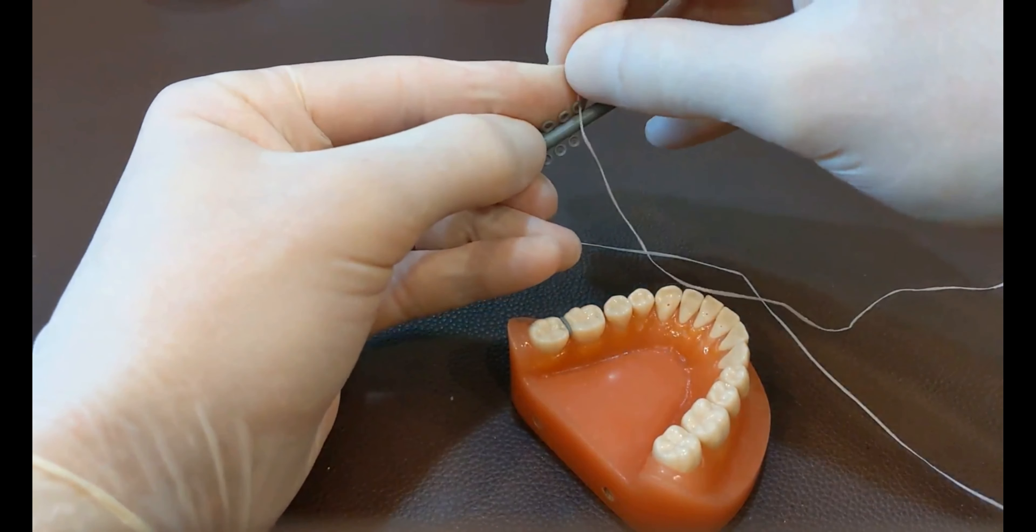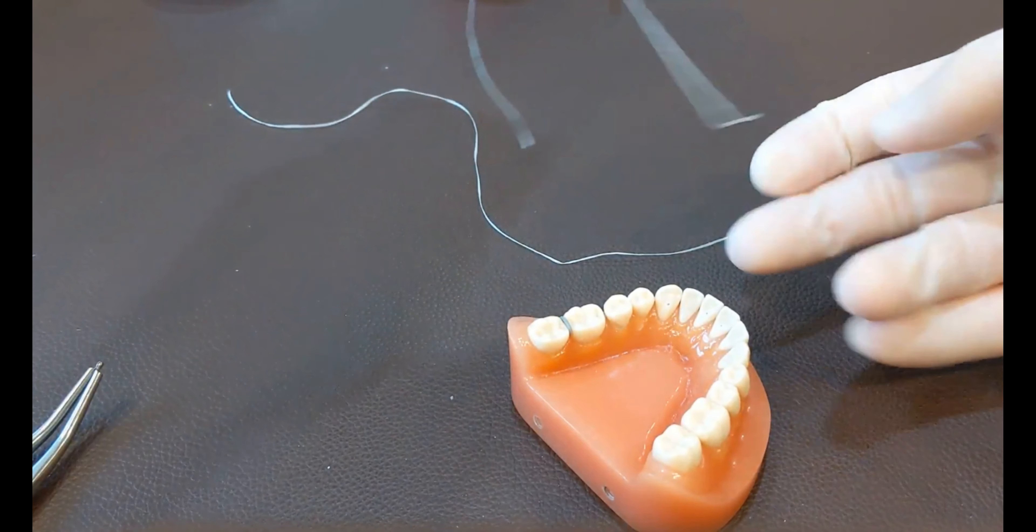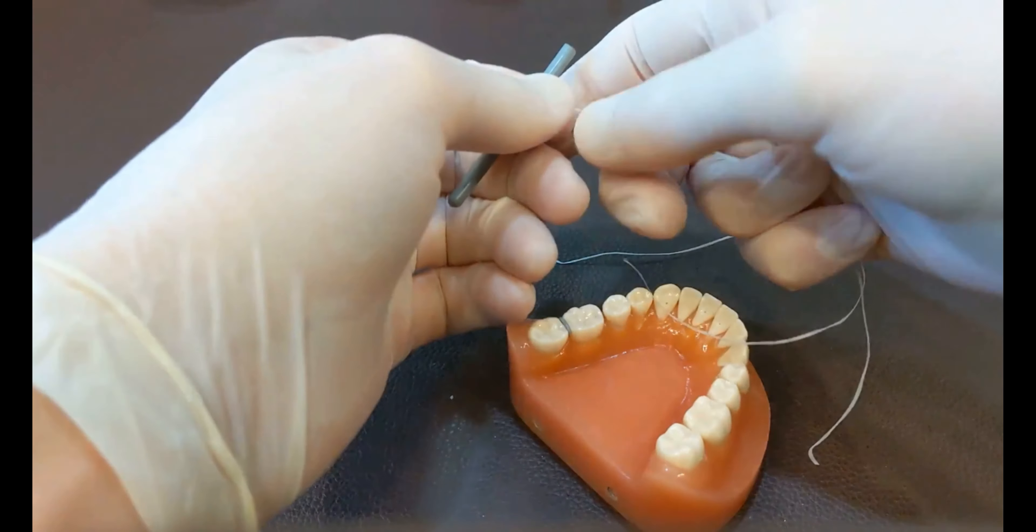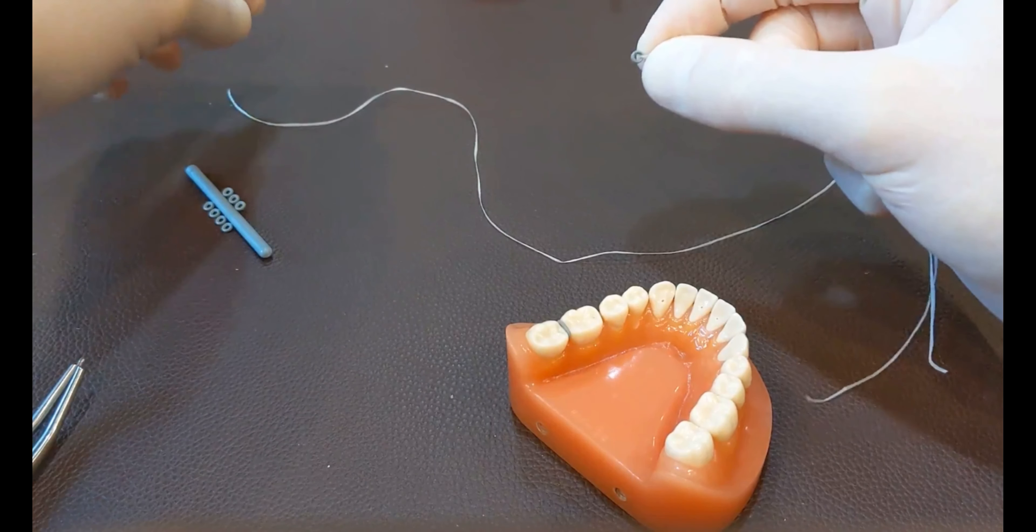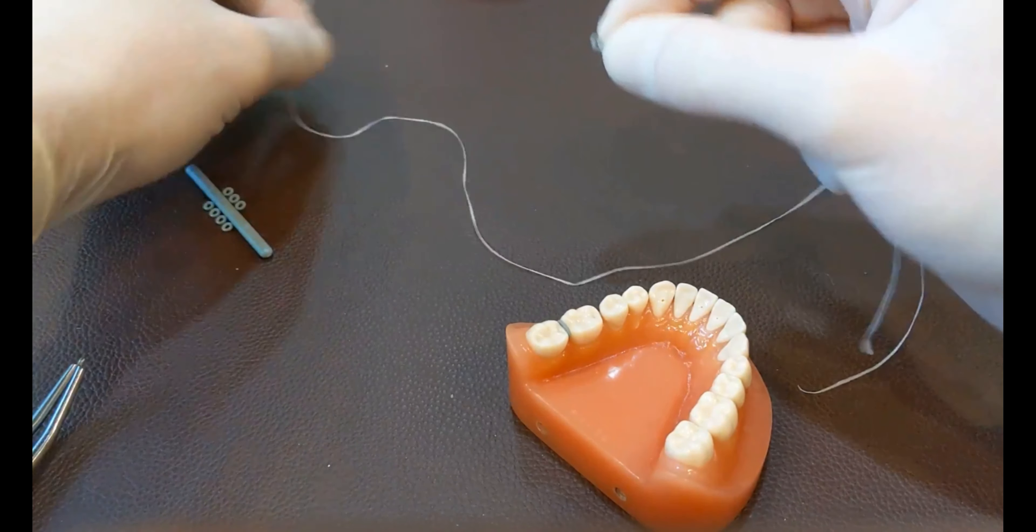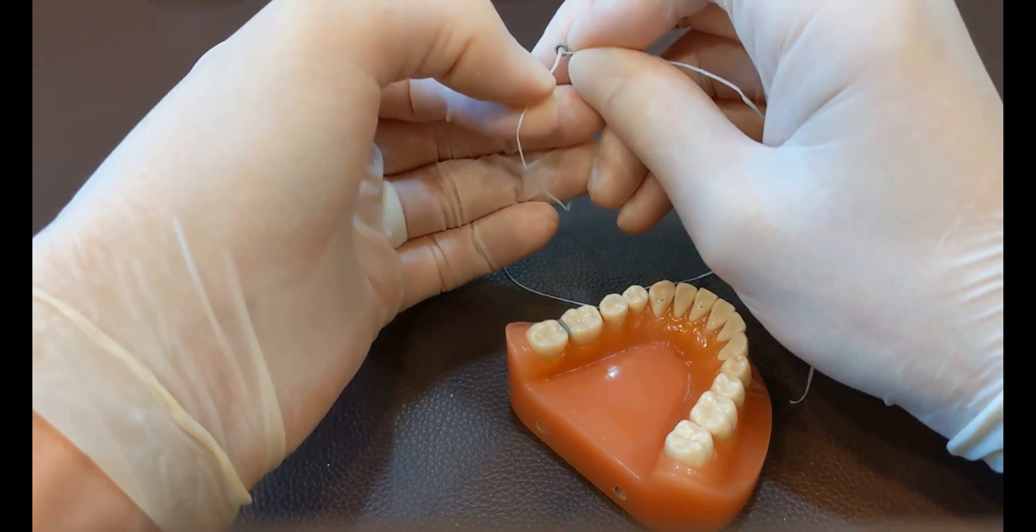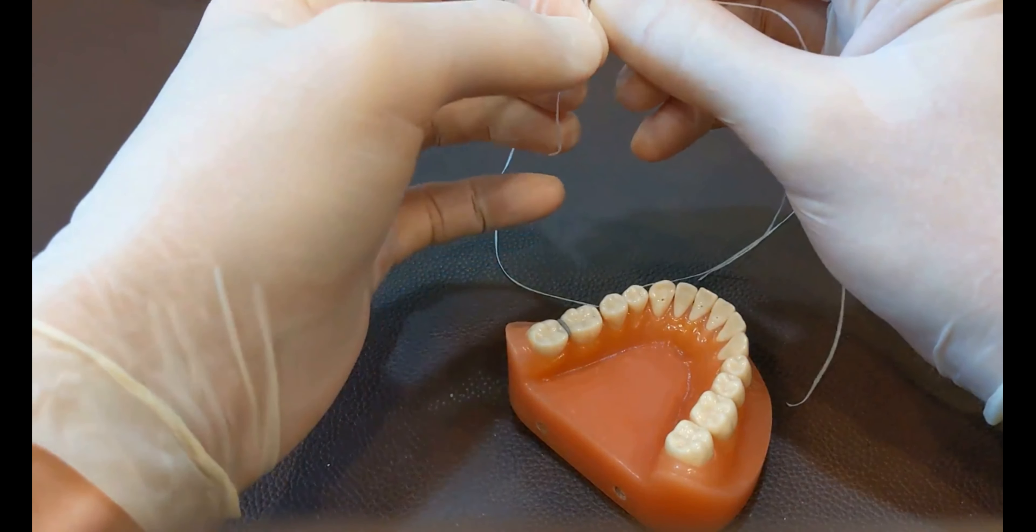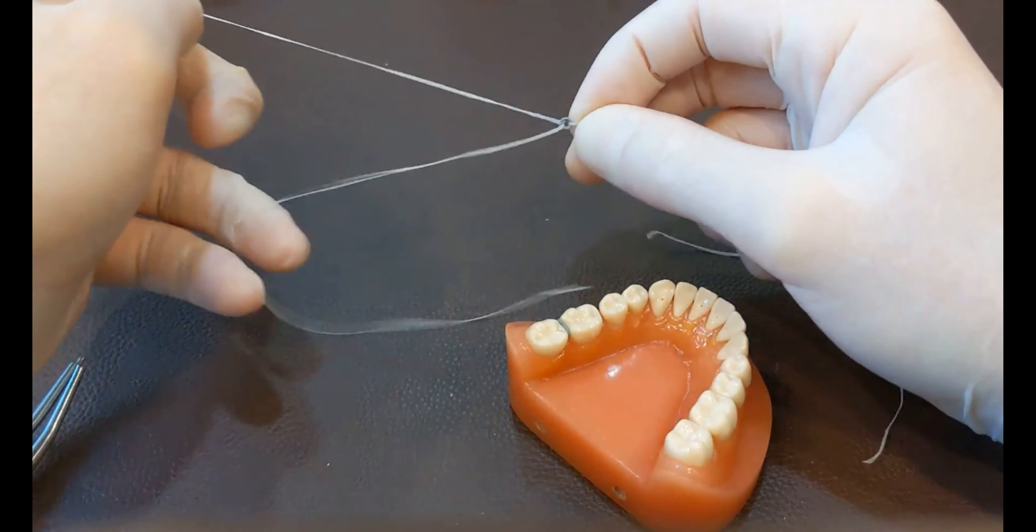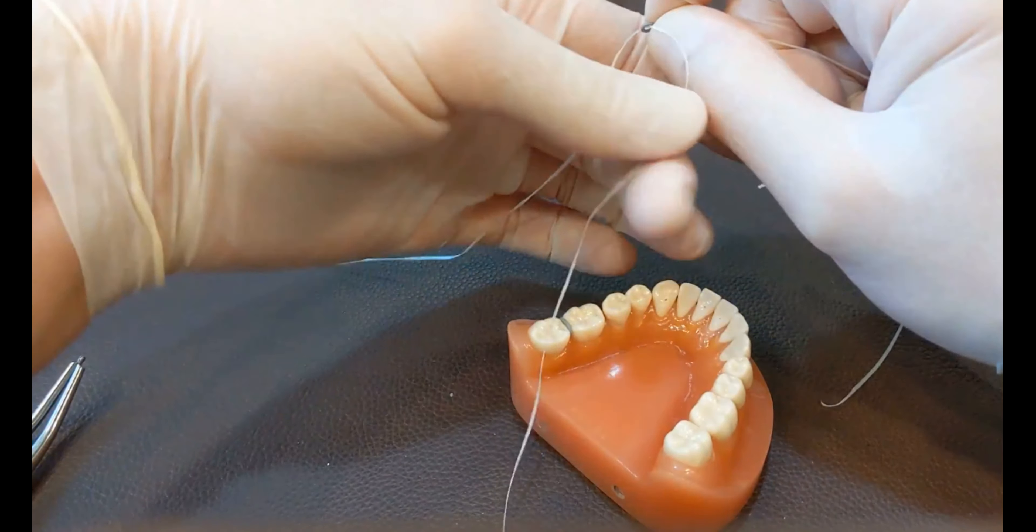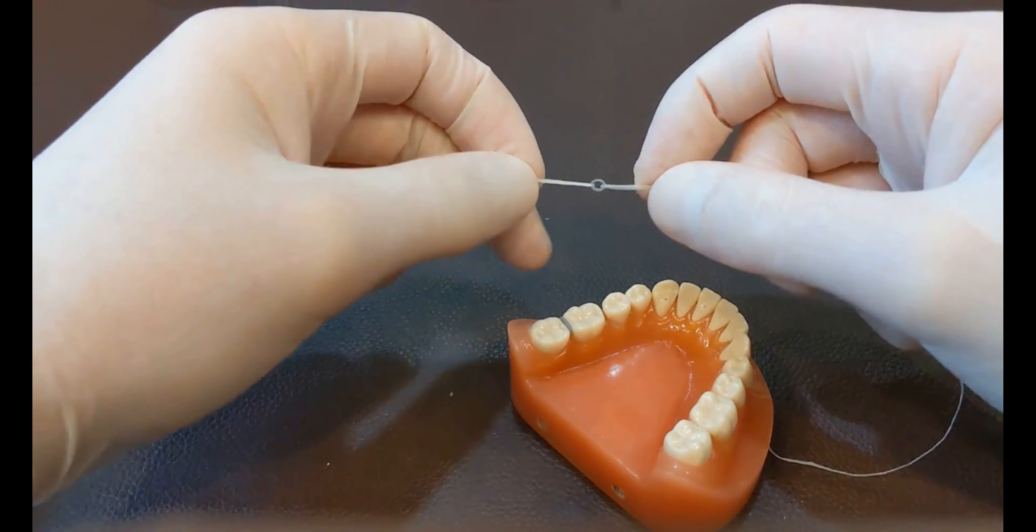So you fit your floss through there, get it about halfway through. You need two pieces of floss about 10 inches long. So you get it through there, and then you just pull it off, and then you hold it like this. And so then you can thread your other piece of floss through there, nice and neat, just like that. And then you grab both halves of that, so you've got it suspended between two pieces of floss like this.